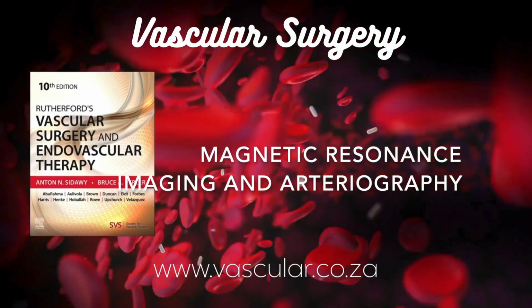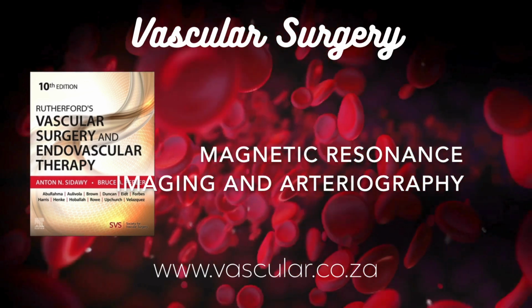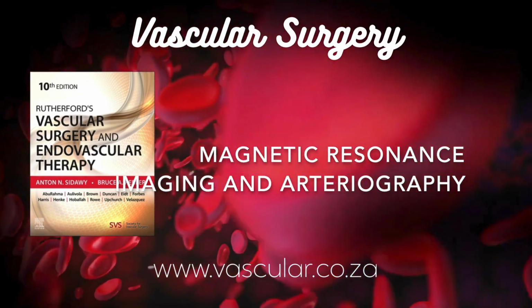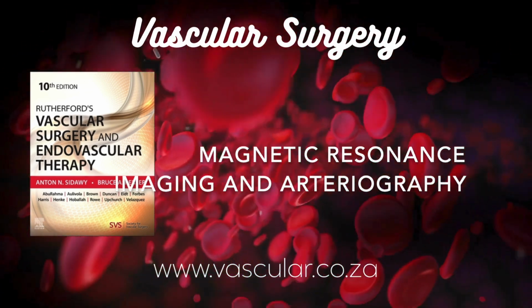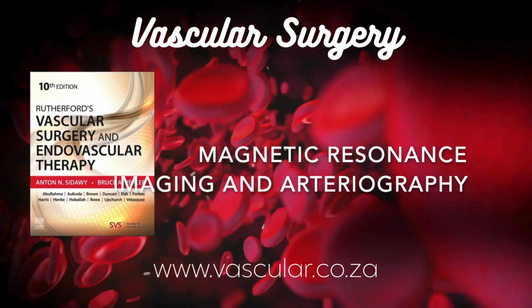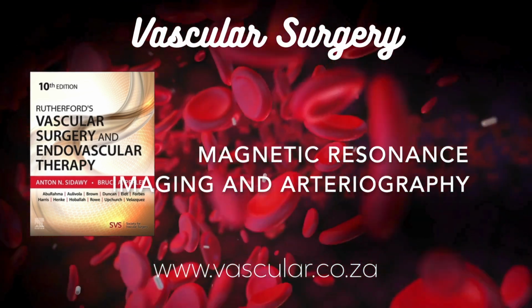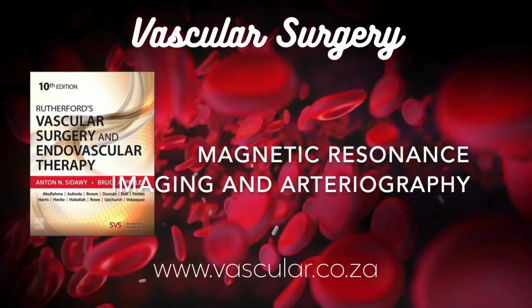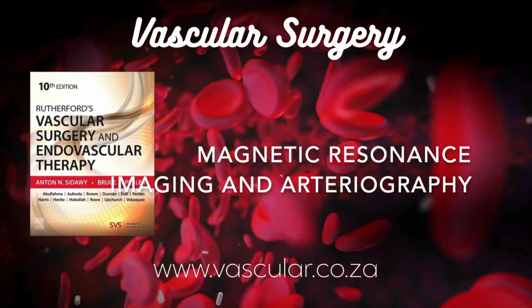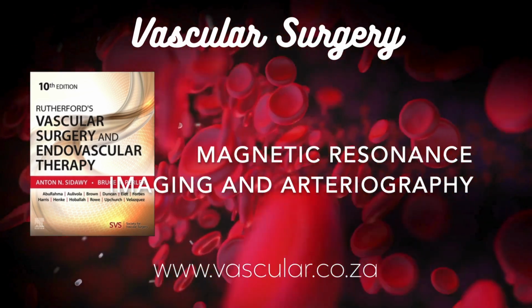Okay, so once we've got all this 3D data, especially from contrast-enhanced MRA, how do we actually look at it? The outline mentioned 3D image processing. Right, because CE-MRA usually gives us these rich 3D data sets. We have a lot of flexibility in visualizing the vessels. Multiplanar reformatting, or MPR, is fundamental. What's that? It lets us slice through the 3D volume electronically to create 2D images in any plane we want: standard axial, cross-section, sagittal side view, coronal, front view, or even angled oblique views. So you're not stuck with just the original scan orientation.